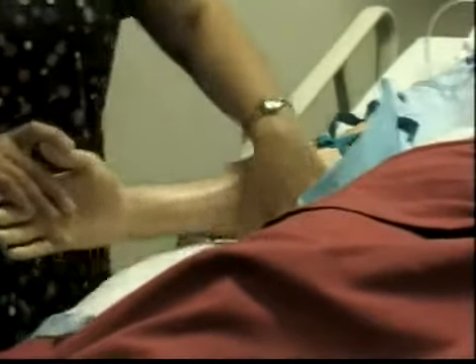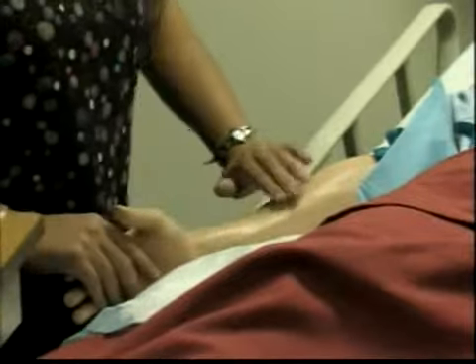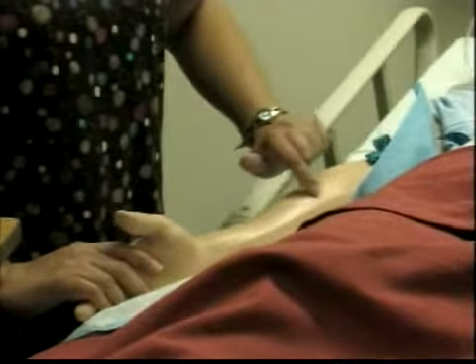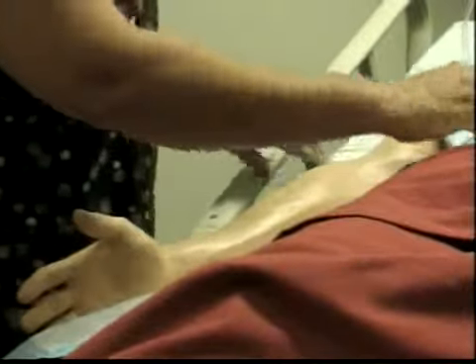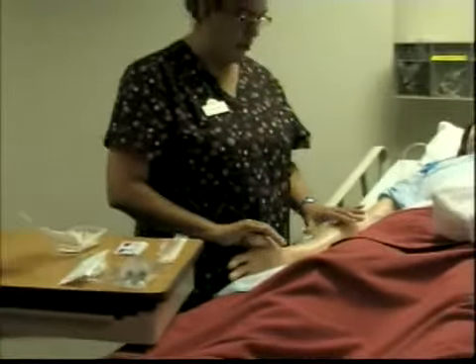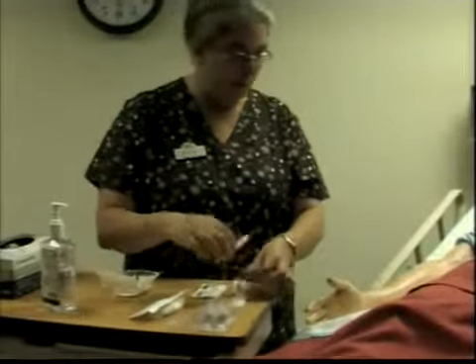There are different ways to do so. You can dangle the arm a little bit and allow the circulation to come down. You can ask your client to pump their fist, opening and closing, or you can softly palpate the vein so it'll fill. So now, I have chosen this vein in this area here to perform the venipuncture. Now I will release my tourniquet and leave it in place so I have it accessible, and I will tell the patient I'm going to go ahead and get all my things together and I'll come back to the arm. So I'm going to make sure that I have everything ready for me.